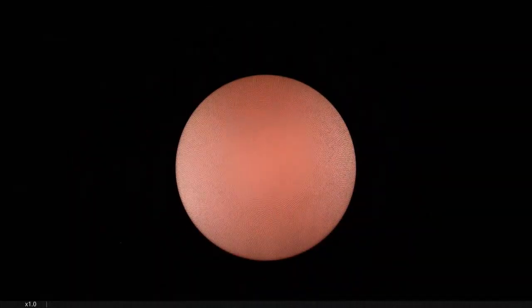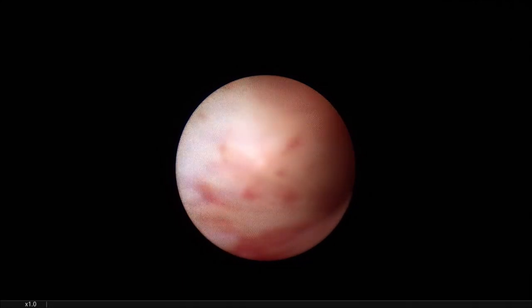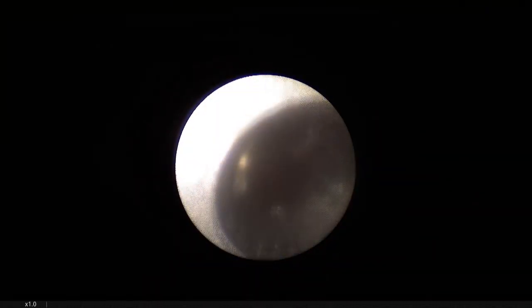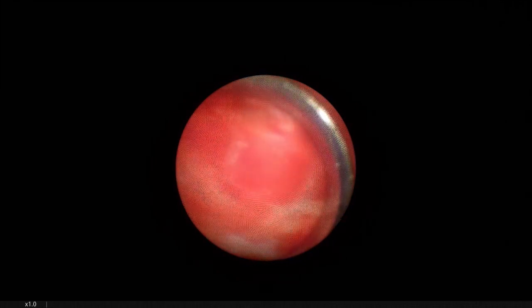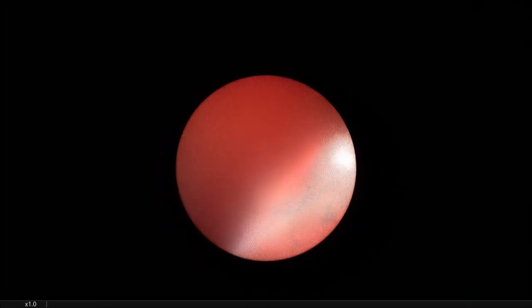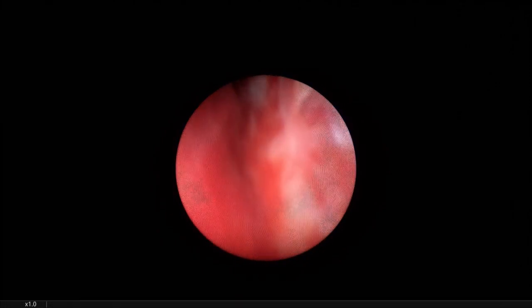And how do you remove large blood clots? I wash them out. How? By irrigation. Not this case. If you find that they are tougher, how do you do it? I can treat the clots with the laser, with the forceps, or wash them out by irrigation. What I do is connect the outer sheath of the nephroscope and do the irrigation through the drainage channel, and adapt an aspiration tube to the main channel of the nephroscope and aspirate them. Yes, and it's very effective. But this leads to higher pressure of the calyceal system. No, on the contrary, there is suction, and with the drainage channel of the nephroscope, there is not a higher pressure of the regurgitating fluid.